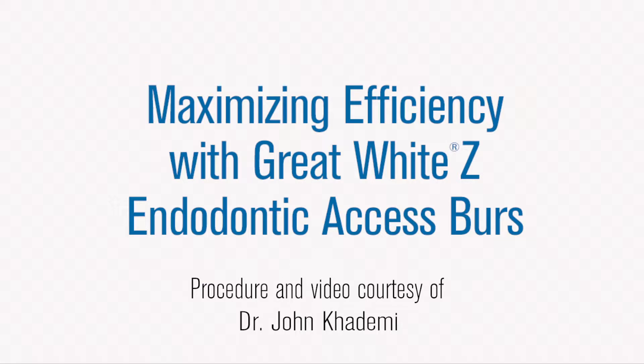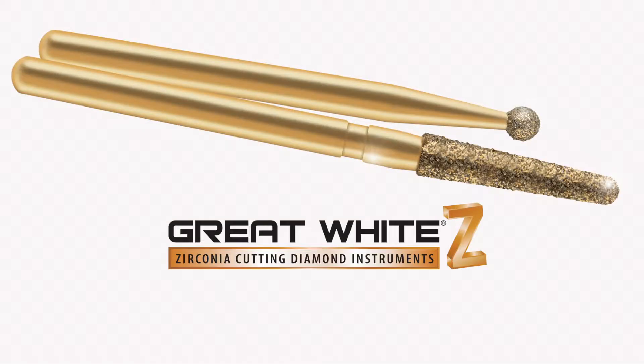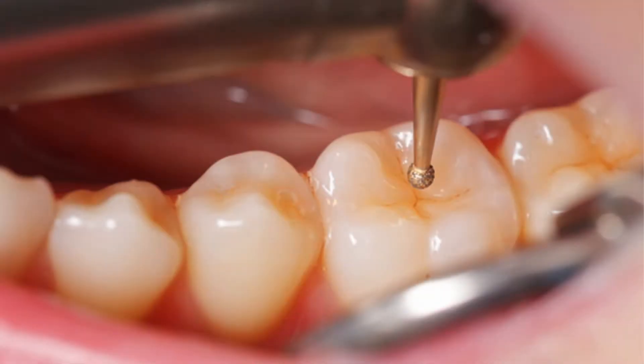This video will demonstrate the high efficiency and time savings of the Great White Z series of burrs for a dentin conserving access through a zirconium crown. Zirconium crowns are notoriously difficult to drill through, but this burr system beautifully solves that problem.